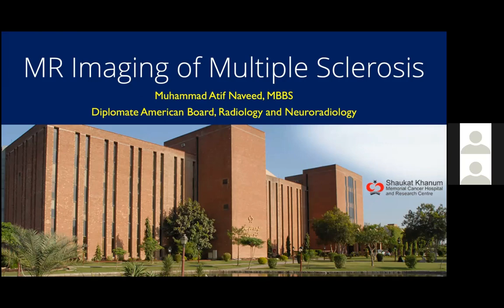So today I'll talk about MR imaging of multiple sclerosis. As we were earlier talking, multiple sclerosis is underdiagnosed in our country, in our region. It's because, from an imaging point of view, there are many mimics which can look like multiple sclerosis. Many diseases can look like that on MR imaging. And also there is specific criteria for diagnosing multiple sclerosis. So that's why it's very important to find a correct diagnosis for multiple sclerosis. And today I'll talk about MR imaging of multiple sclerosis.